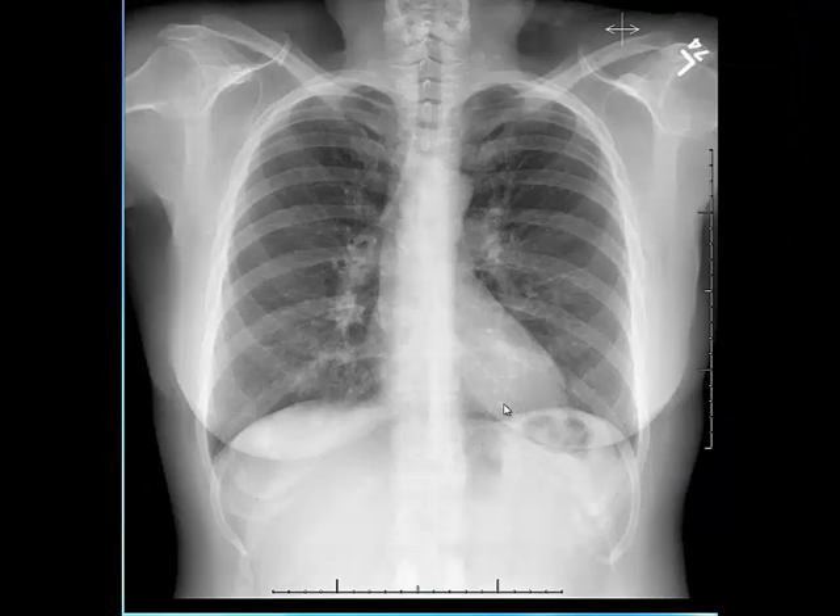The first thing I evaluate on a chest radiograph is the technique. First I evaluate the degree of inspiration. For a well-inspiratory film I would like to see at least nine posterior ribs or six anterior ribs covered by the lung parenchyma. For example here we see one, two, three, four, five, six, seven, eight, nine and almost ten posterior ribs covered by the right lung parenchyma, meaning that this film has good inspiratory effort.